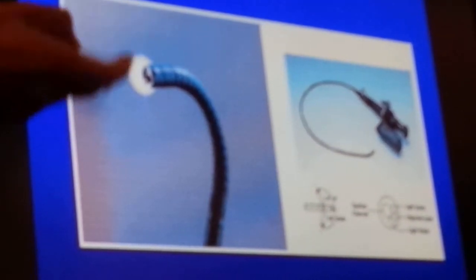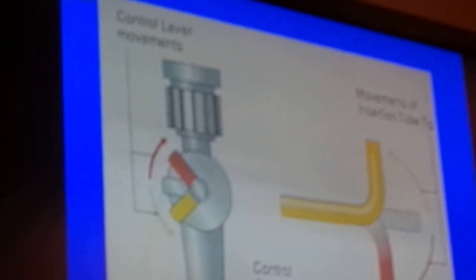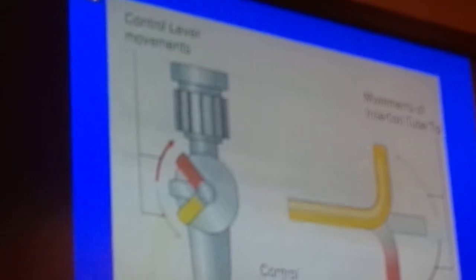The bronchoscope has a camera, a channel. This is the objective lens. We have two lights, and we have a lumen for suction and for insertion of the catheter. The tip of the bronchoscope moves anteriorly and posteriorly with 120 degrees, with the use of this lever. There is a tube here actually, we are not talking about the awake intubation. So you have to keep the bronchoscope straight all the time, and this is how: you push down the knob, the tip will flex up and vice versa.